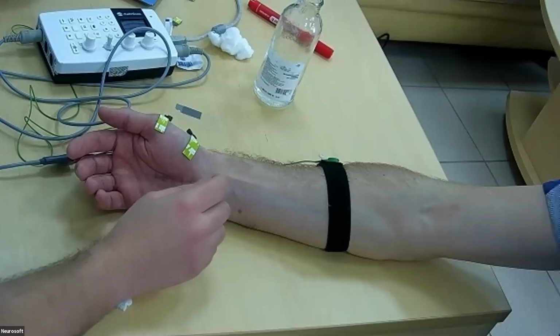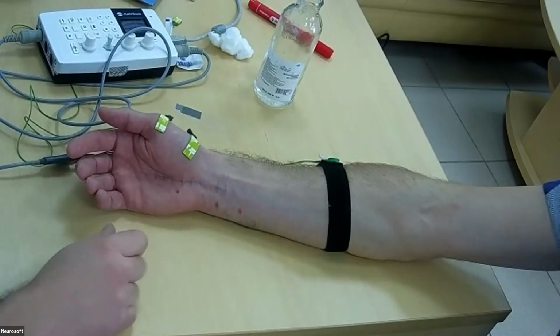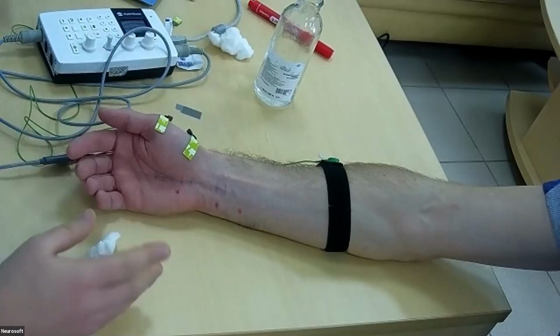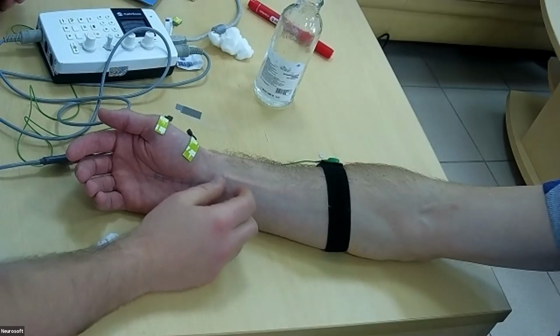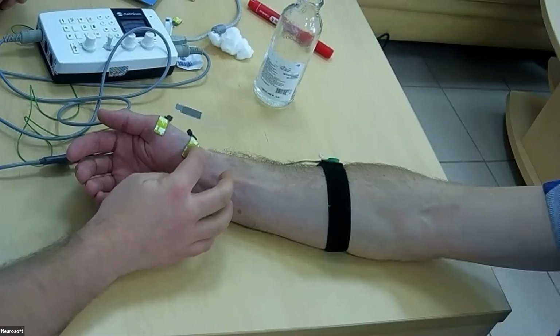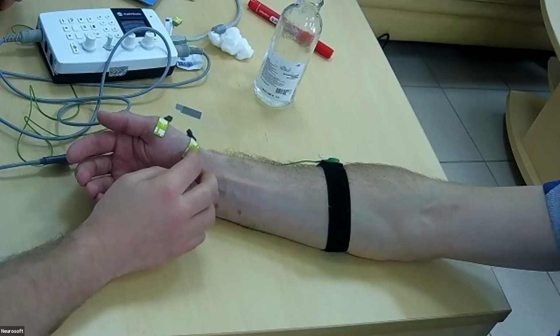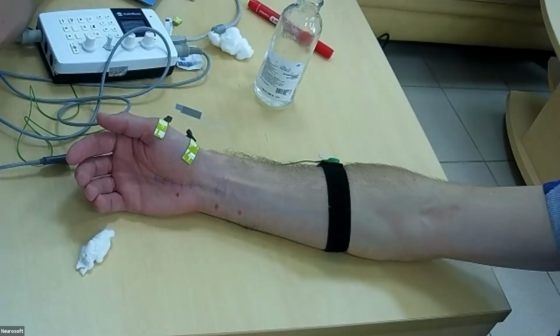So we need different types of tension, as Michael said. First of all, for this method we need to perform the motor conduction study with registration of the compound muscle action potential. So we will start the demonstration.